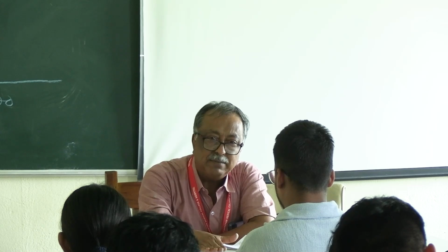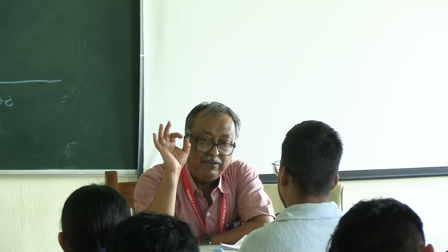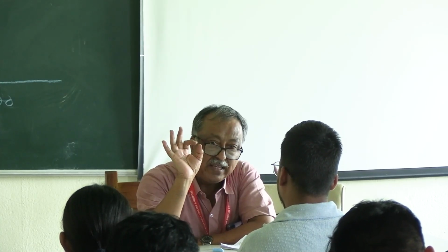That is, the sensational level of the speech audiometry is always above the threshold, above the hearing level.